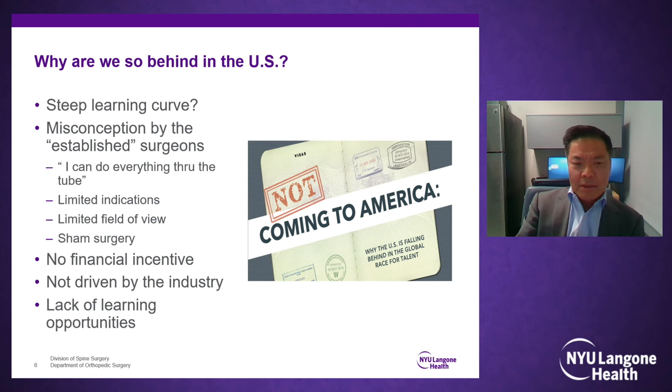And I looked into why. It seems everyone is daunted by the learning curve. There's also a significant misconception among established surgeons who've been doing this for a long time. They say, oh, I can do everything through the tube, my incision's just as small as yours. They also feel the indications for the surgery are too limited, and I think that stems from the old percutaneous discectomy misconception of indications and what it could do. They also feel that the field of view from endoscopic surgery is limited, which is not true. In fact, the view you get from endoscopic surgery is much better than open surgery.